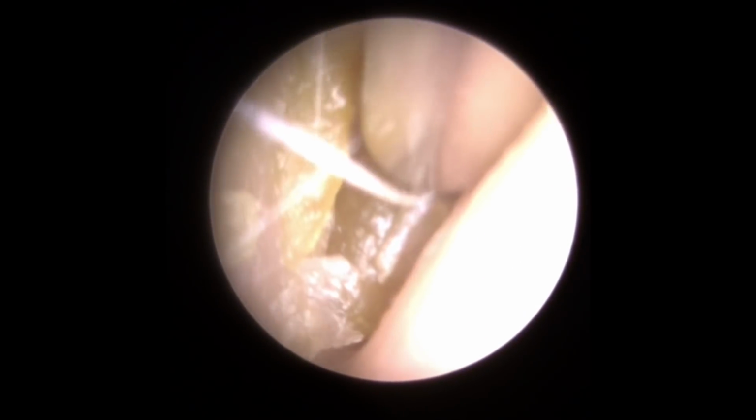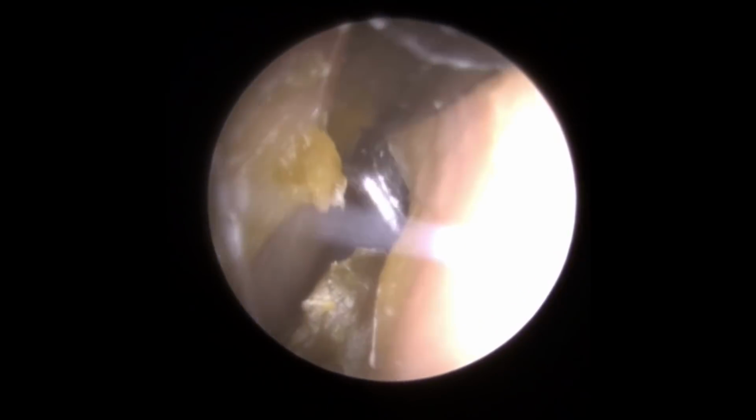So you'll see this patient has some very, very dry wax, very narrow ear canal, and when I say dry, this wax is solid. It is like a stone in this patient's ear. Got a nice big gap at the top of the wax. Can easily accommodate the width of the end of the Jobson horn, that L-shaped end. You can get behind it safely, and when you pull, because the wax is really solid, it's going to bring it all out in one go.